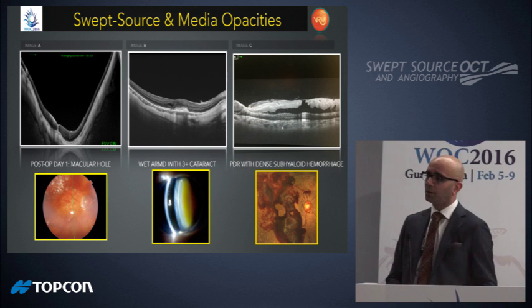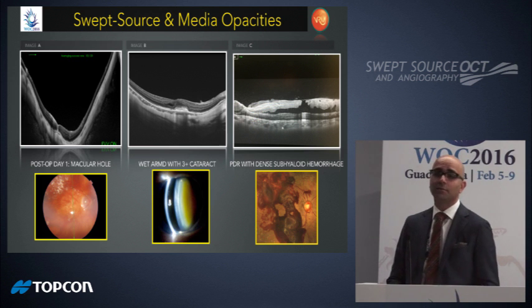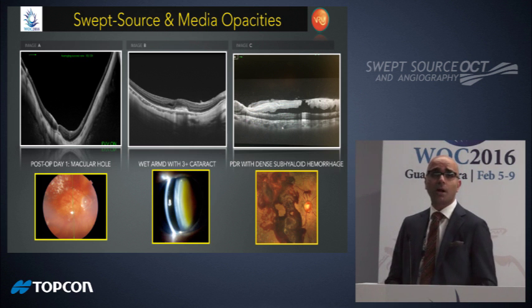So just in the last week, I put together these 3 cases from patients that came in the clinic. We can see a patient here with post-op day 1 macular hole surgery. This is a patient with post-op day 1, 95% SF6 gas fill. The fovea is clearly visible. Obviously, this is a very myopic fundus. There were no adjustments made in order to acquire this image. The 1050 nanometer wavelength goes through this very easily.